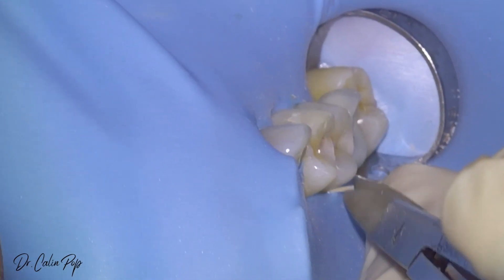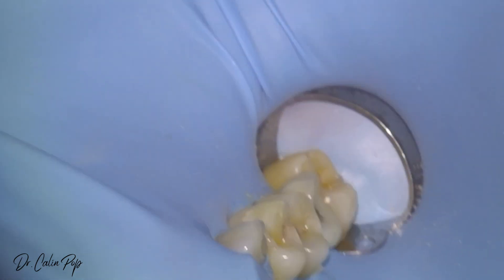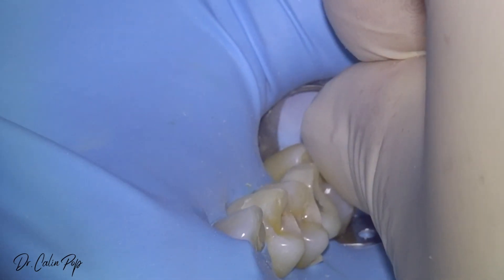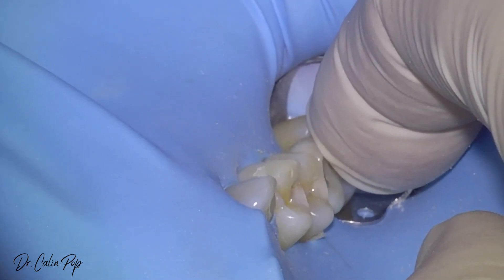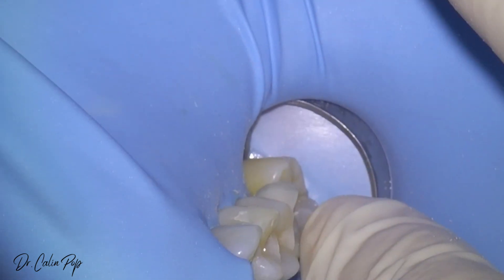So you have tight contacts when you try to deliver the onlays, which might be okay in the try-in phase where you don't have the rubber dam. And then when you put the rubber dam on, you notice that you cannot insert it. Or you do a class restoration, you clean everything, it's perfect with the rubber dam on, then you remove it — this tooth will go back and you'll have an open contact and you don't know why.